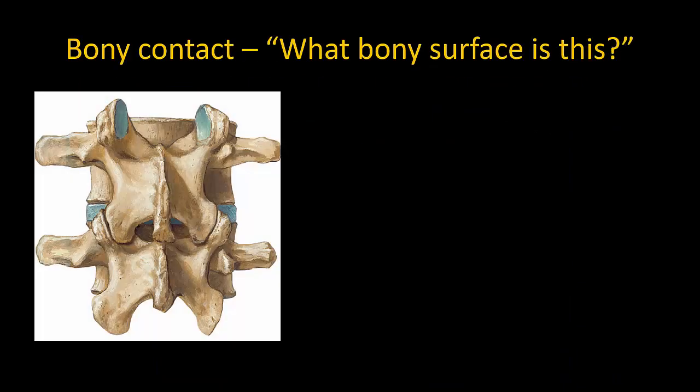A final few tips to end. When you strike bone, and you will strike bone at some point in some patients, use this to gather information and map the bony contours of the vertebra. Ask yourself, what bony surface is this? And confirm it by making a direction and see what happens.